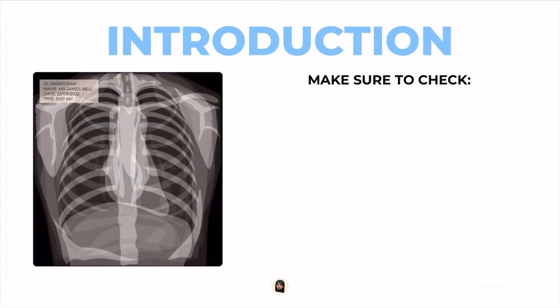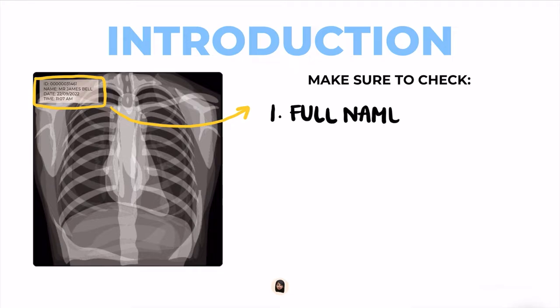Let's begin with the introduction and checking the x-ray details. In every x-ray, probably on the top left, there are three key labels, and it's important to double check all of them. Number one, that's the patient's full name, number two, the date, and number three, the time. Once you confirm all these three details, then you can move to the next step.